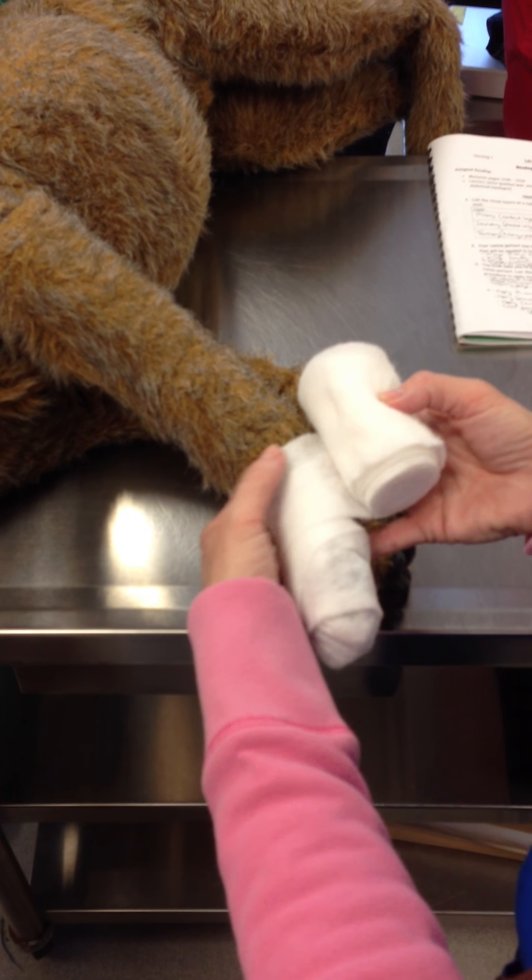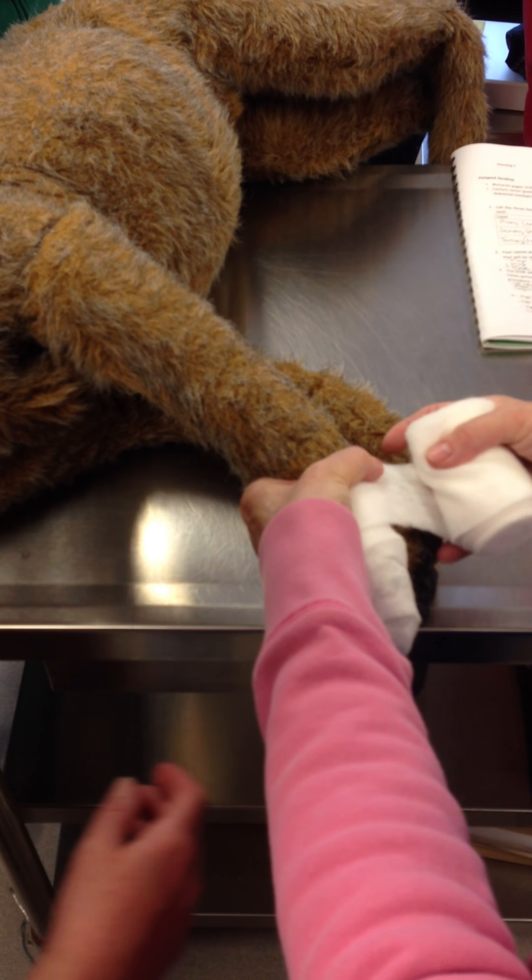At 50%? Yeah, so about there — right about there. That's plenty far enough up the leg. Now we need lots more padding.